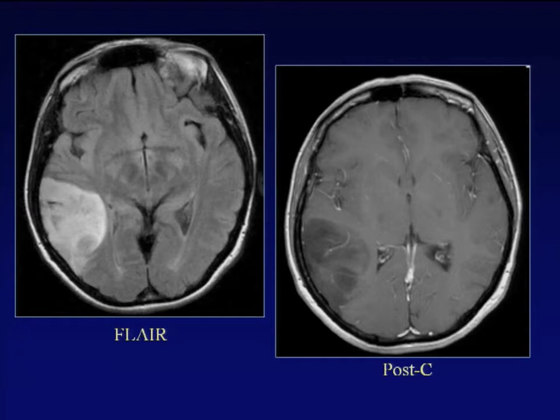And remember, before we go to all these advanced neuroimaging techniques, for example spectroscopy or perfusion, it's very easy to differentiate an infarct from a tumor. But remember, we are physicians, not only radiologists. So we can ask the patient the history. The history here is the key factor. If we're dealing with an infarct, the history is an acute neurologic deficit. And the history could be totally different if we were dealing with a brain tumor, in this case an anaplastic astrocytoma.